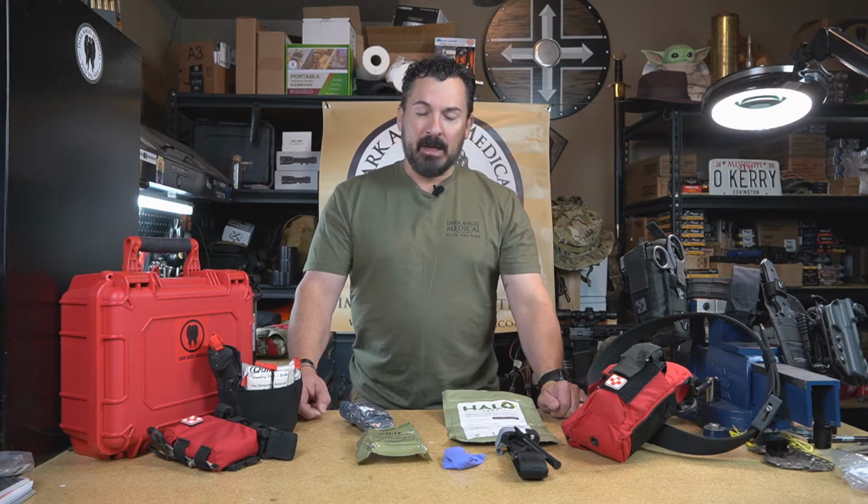But what I like to narrow it down to is in order of importance. Okay, so we always talk about stop the bleeding, start to breathe, and treat for shock, or our trauma man thing where it's tourniquet the limbs, pack the junction, seal the box. I like to call it my top 5. So we're going to call this video Pocket Doc's top 5 items that should be in a trauma kit at a minimum.